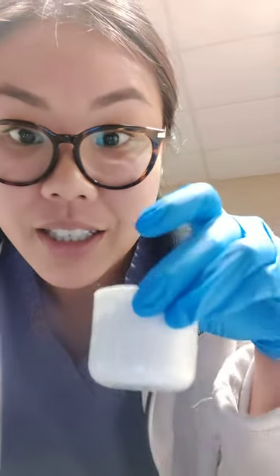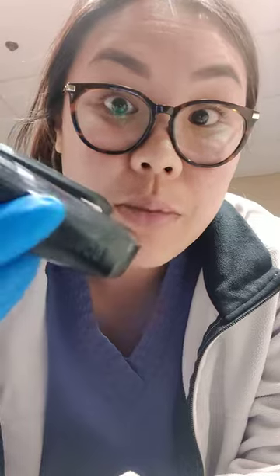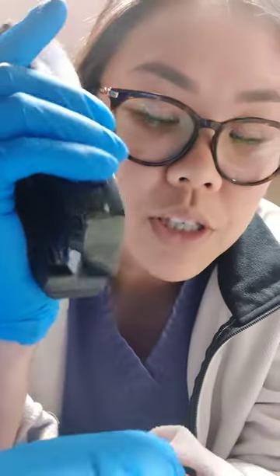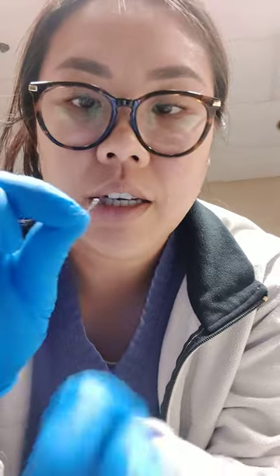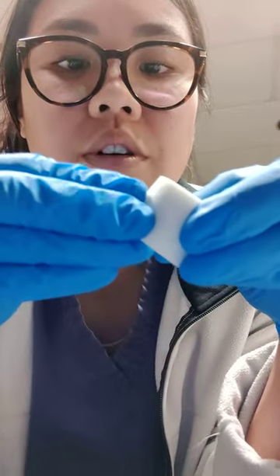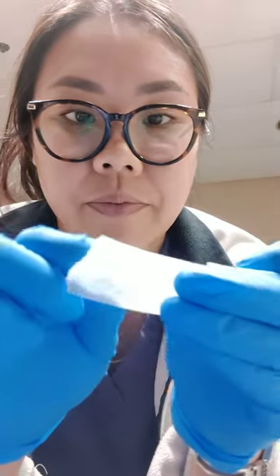The other time, I couldn't find the BBs, so I actually used a stapler. You can use like a safety pin or something. What you do with the stapler is you get a little piece of the staple. And then, so there's a little metal there. You just get tape. And I do this both for the BB and the stapler. I don't want this to cut the patient, so I just fold it.